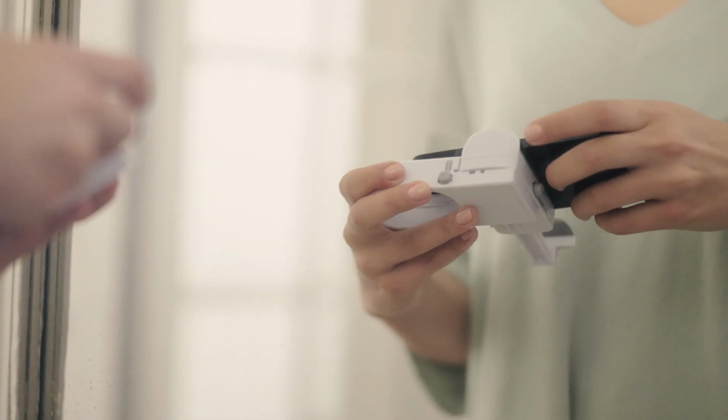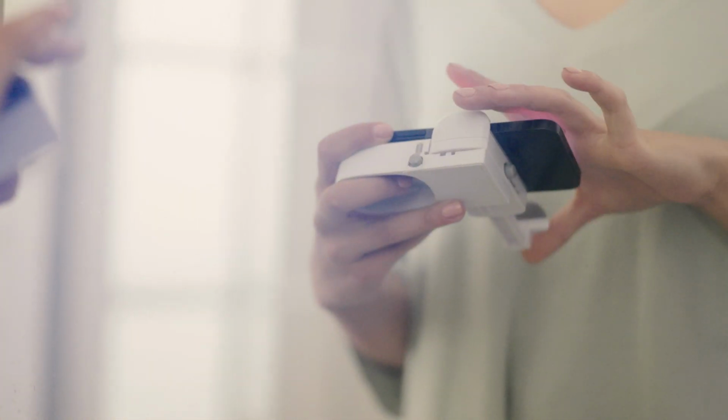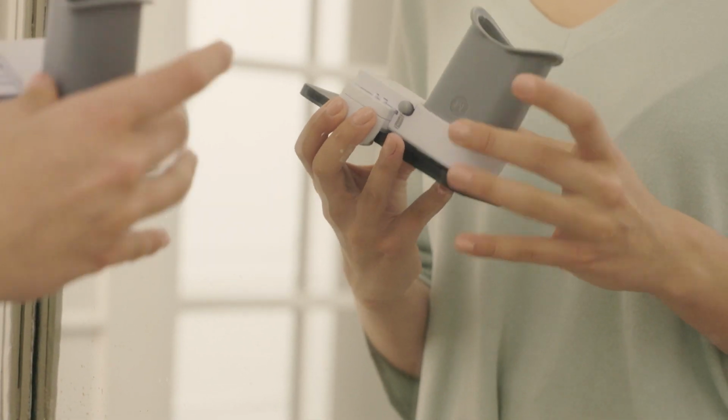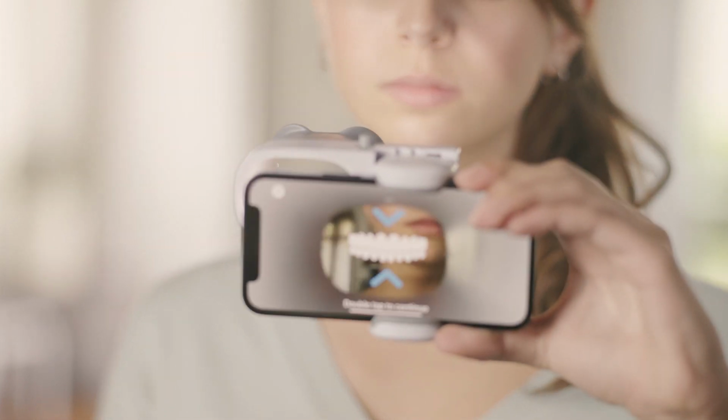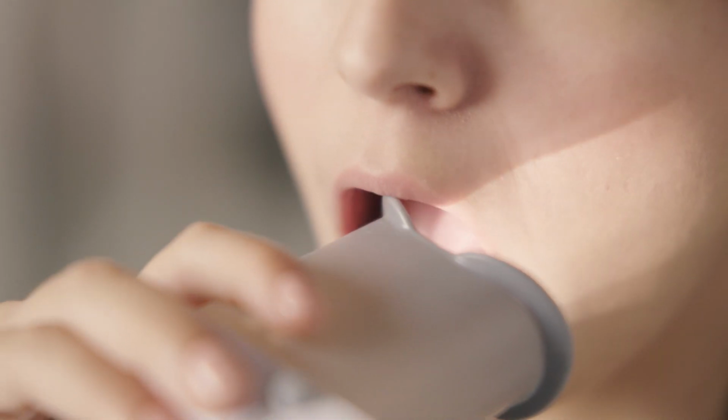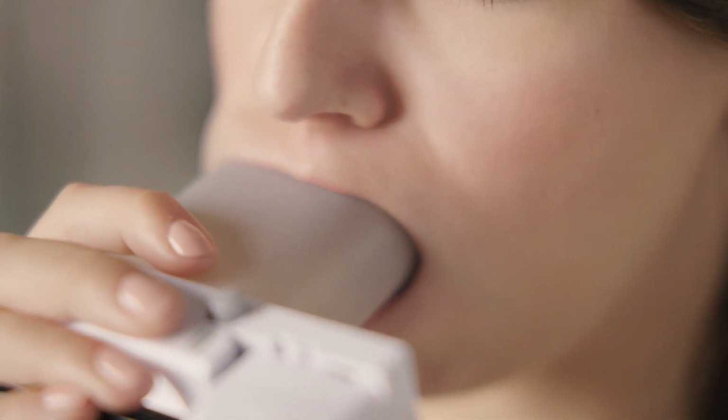Place your phone into the phone support. Insert your cheek retractor tube into the phone support. You will hear a click when your phone support is properly attached to your retractor. Hold your scan box with one hand on the phone and the other hand holding the tube. Insert one side first, then the other.